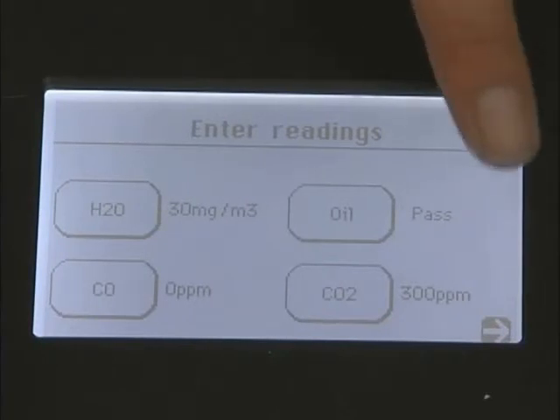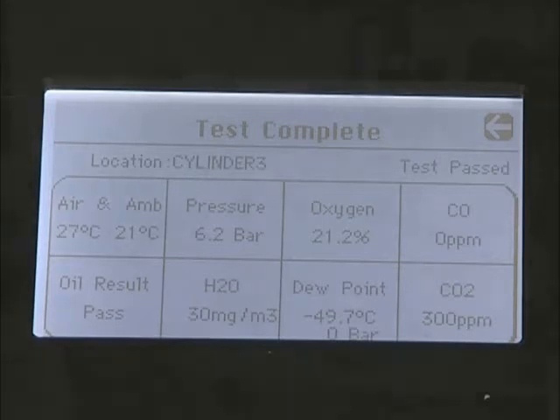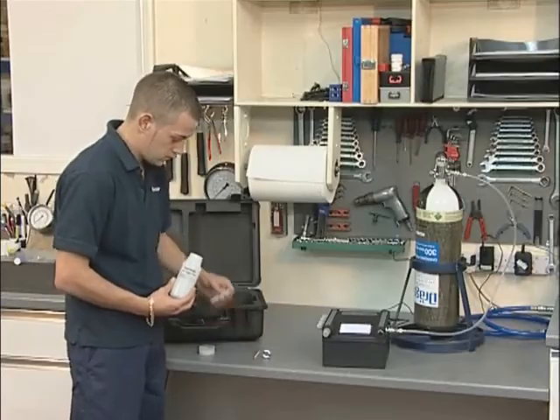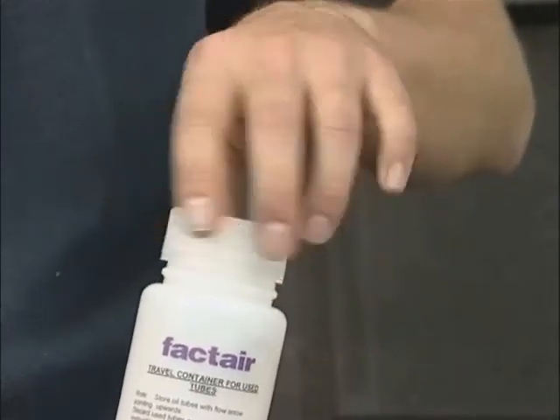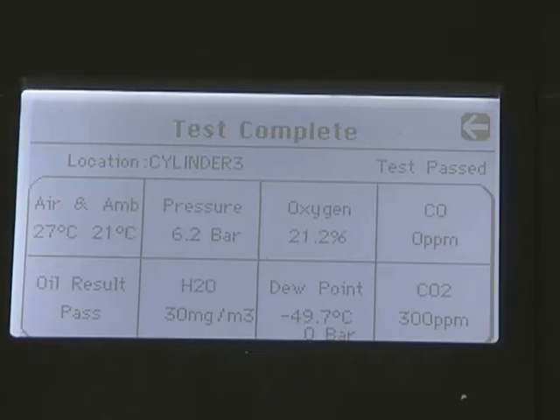Once all readings have been entered, press the right arrow key. Once you proceed beyond this point, the results cannot be altered. Spent tubes should be placed in the container provided for disposal in accordance with the manufacturer's instructions. The test complete screen automatically determines whether the test was a pass or fail and displays all the measurements recorded during the test.